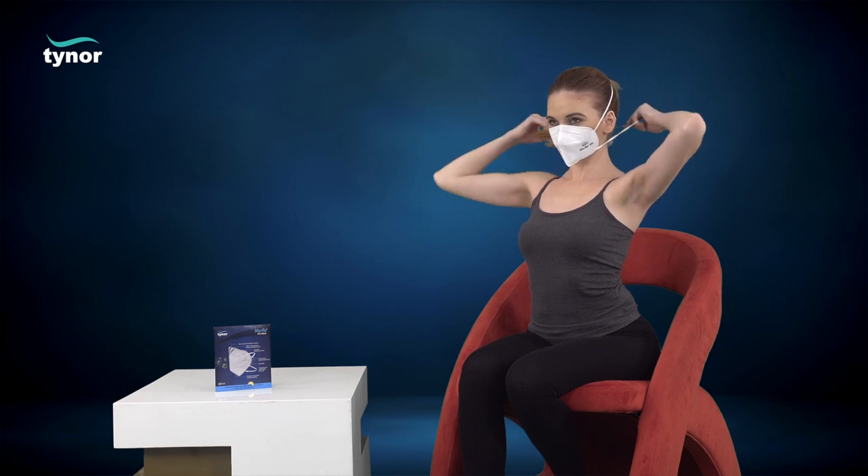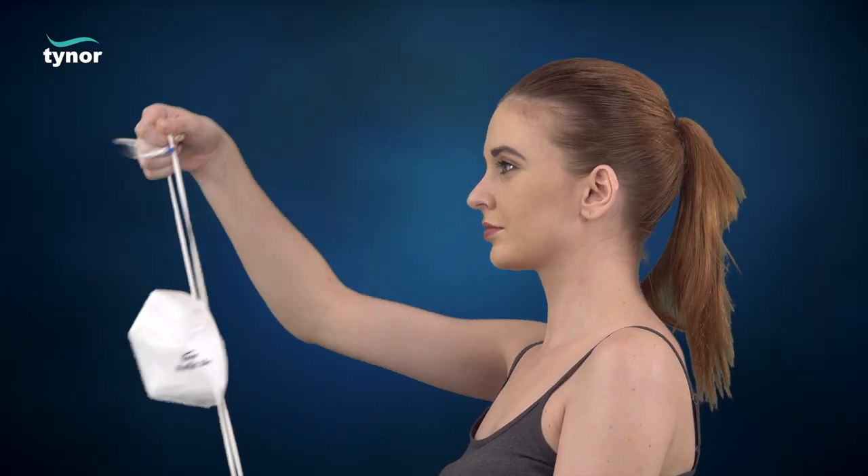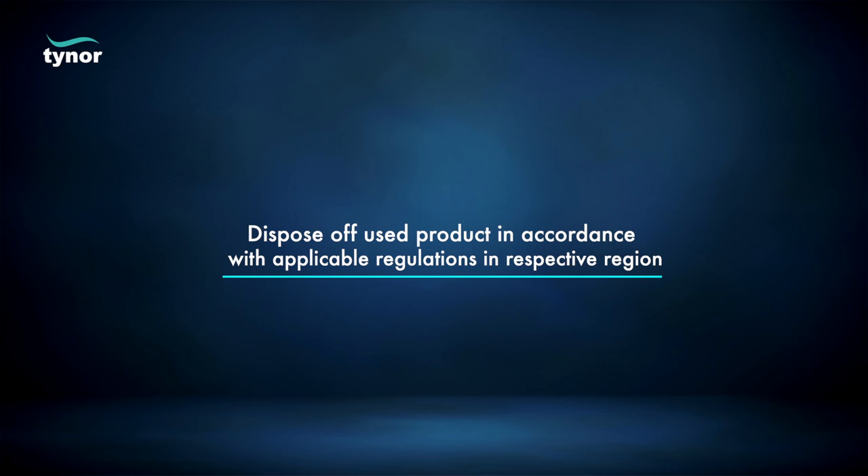Now let us see how to remove the mask. Sanitize your hands. Cup the mask in hand to maintain position on face. Pull out the bottom strap over the head. Still holding the mask in position, pull out the top strap over the head and remove the mask. At the time of disposal, dispose of used product in accordance with applicable regulations in your respective region.